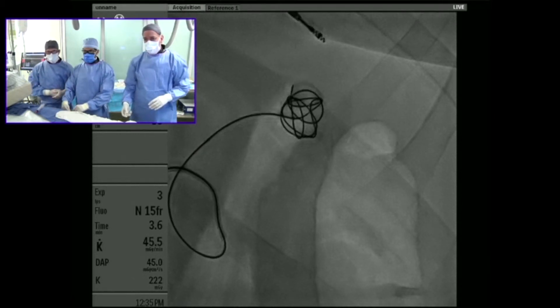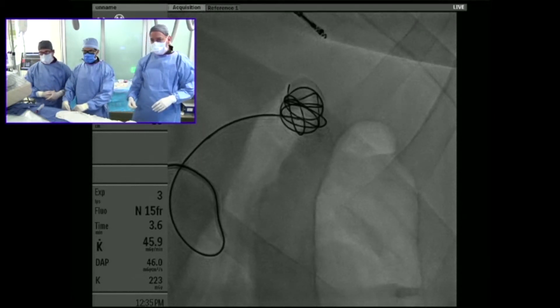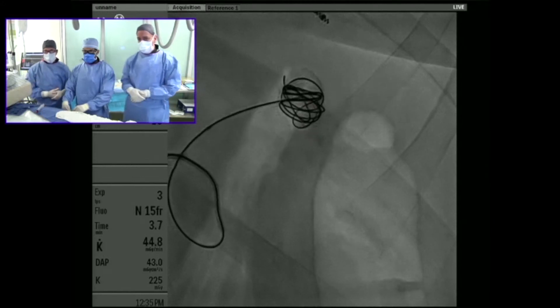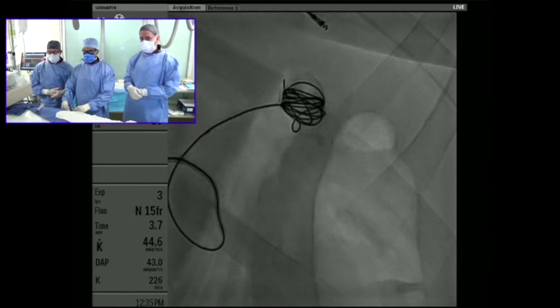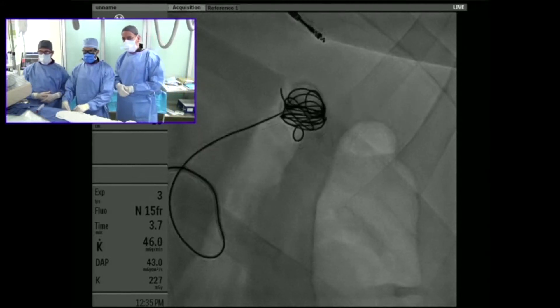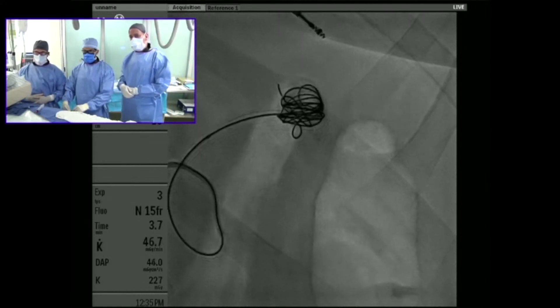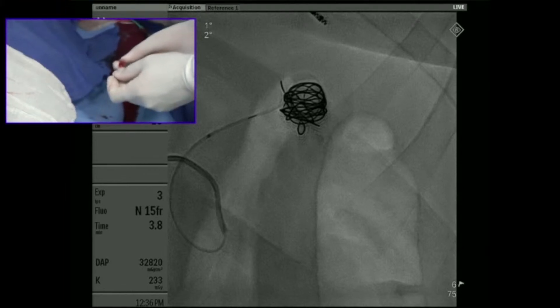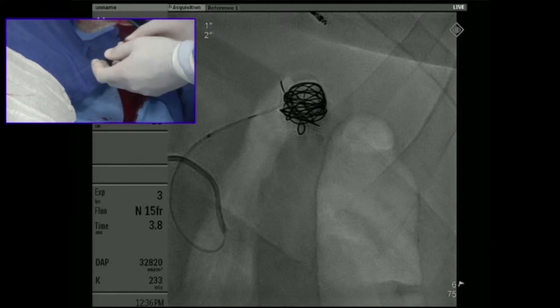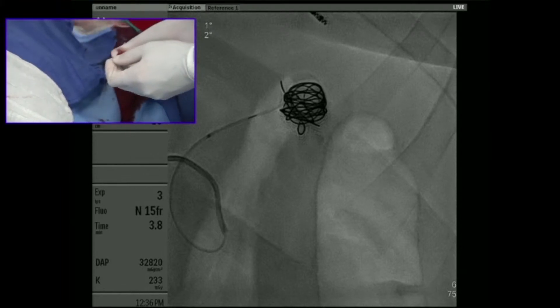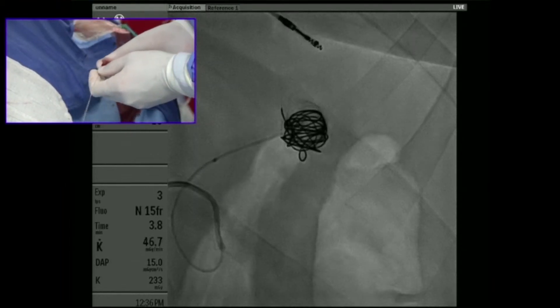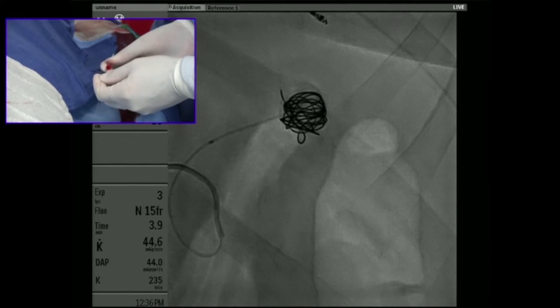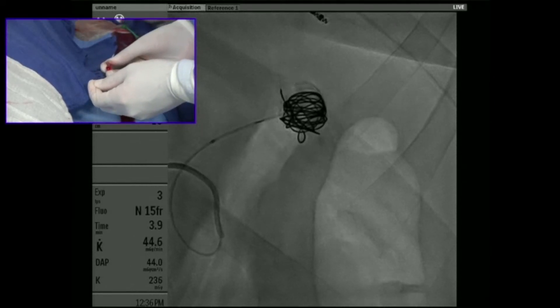In this particular patient there are actually three outflow vessels, so we decided the case would probably be much safer to coil the aneurysm sac and leave the outflows. As you can see on the simultaneous screen, this coil is attached to the pusher wire, and as I retract my hand I'm actually able to retract the coil — it is still attached to the pusher wire.